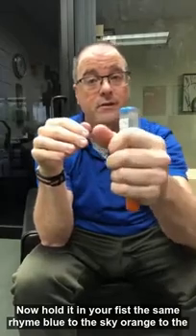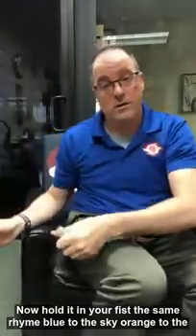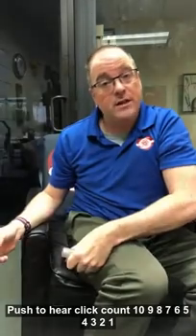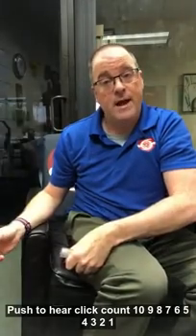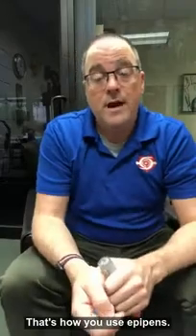Now, hold it in your fist. Same rhyme. Blue to the sky, orange to the thigh. Push till you hear a click. Count to 10. 9, 8, 7, 6, 5, 4, 3, 2, 1. That's how you use Epipens.